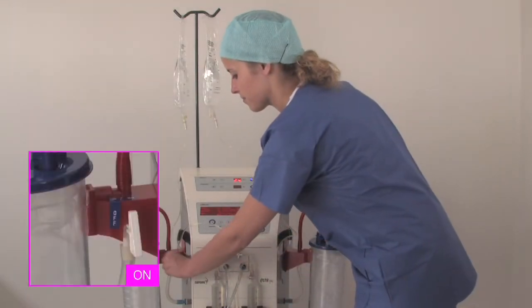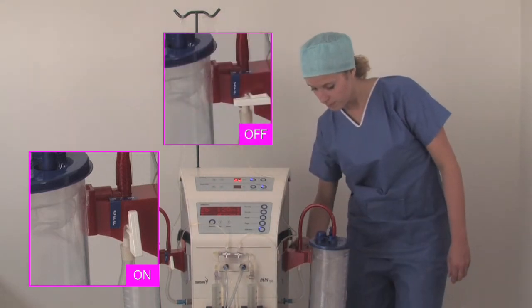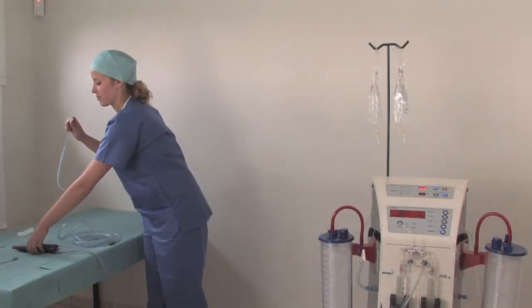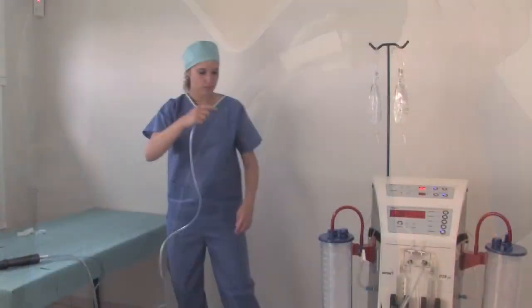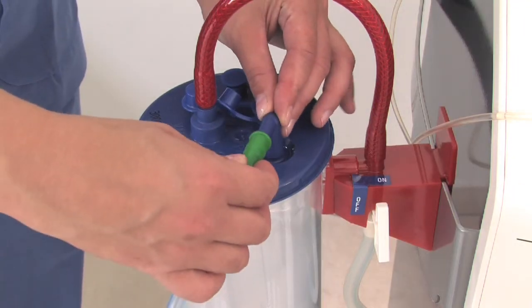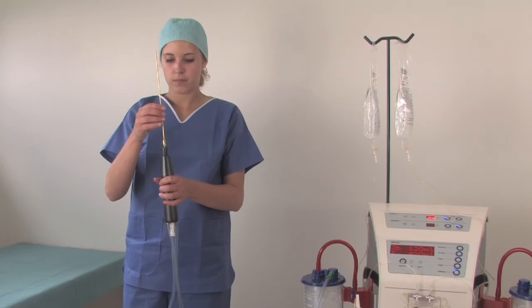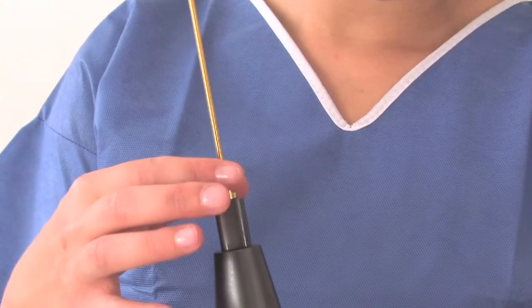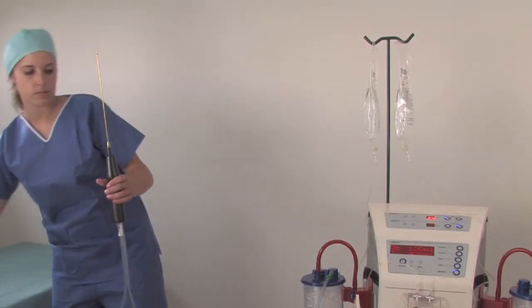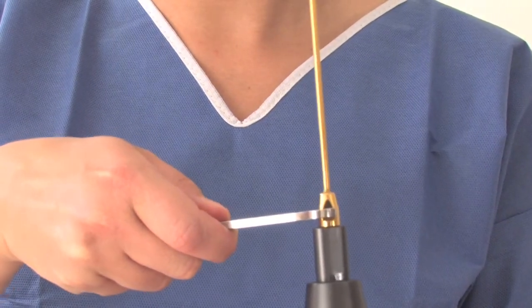Set to on position the canister which will be used and check that the second is turned off. Connect the white nozzle of the fat tubing to the central connector of the Lipomatic. Connect the green nozzle of the fat tubing to the canister lid. Screw the aspiration cannula on the Lipomatic, making sure not to cross threads. Use the chuck key if necessary without forcing the screw thread.